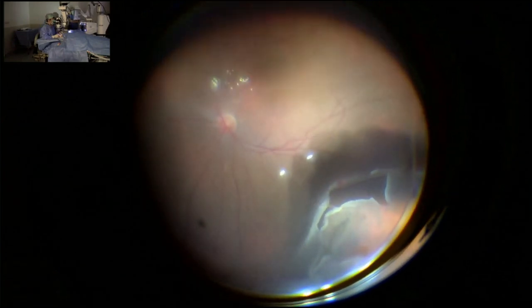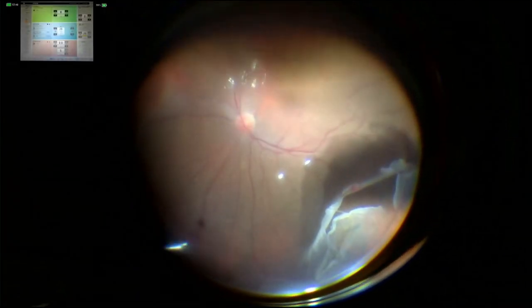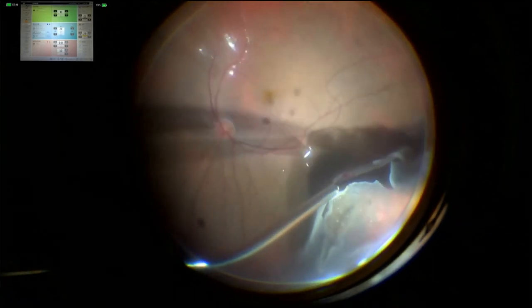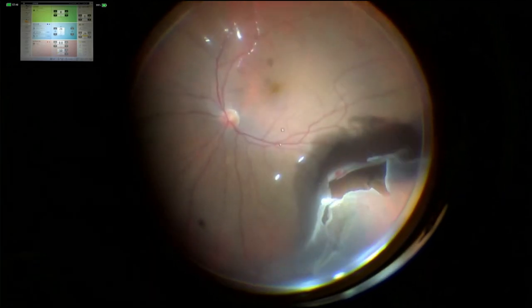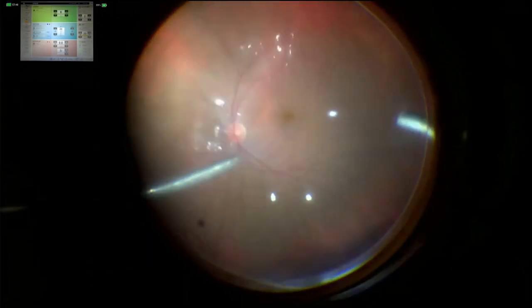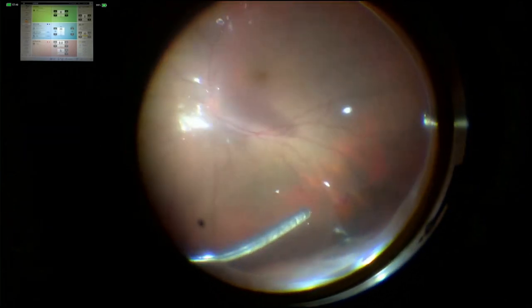Could you please give diathermy to prevent bleeding later on? So this is the bridging vessels here. Yeah, it's okay. But I don't need to cut it. So, okay. As you see, the posterior pole is attached, but the periphery is detached. So, you can see the tear here.